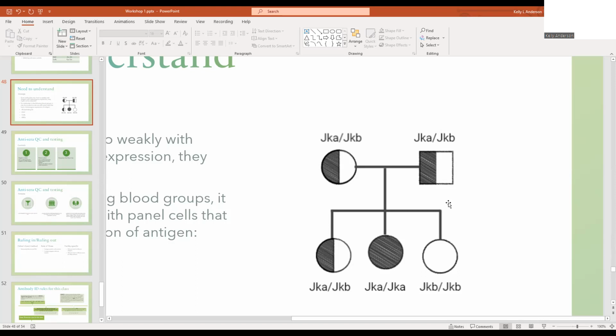So this makes a little click whenever it's done spinning. I'll let you know it's done. So, I'm going to pass this around. Keep it to yourself what you think it is. So write down what you think it is and if there's an ABO discrepancy. So there's some positive reaction. Exactly.